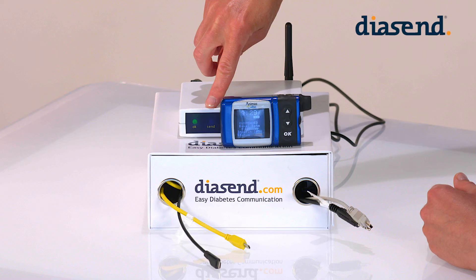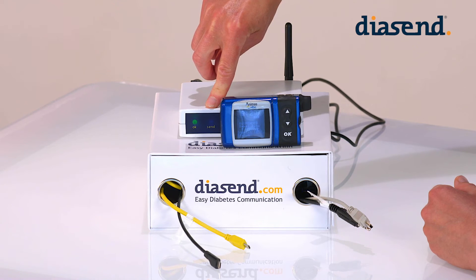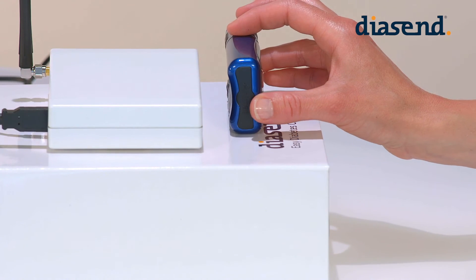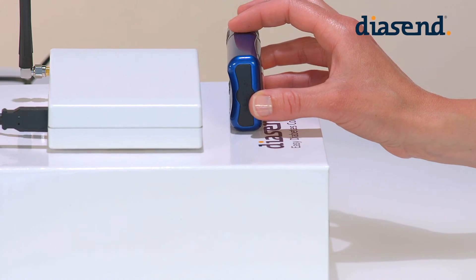Should nothing happen when you have placed the pump in front of the infrared eye, this will take a few seconds. Then first try and move it a little to ensure the eye on the back of the pump is facing the infrared eye on the transmitter.